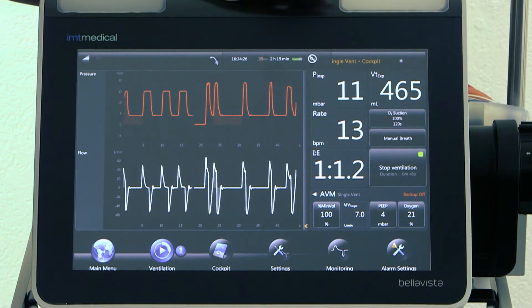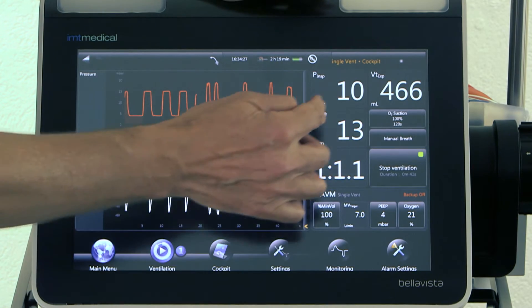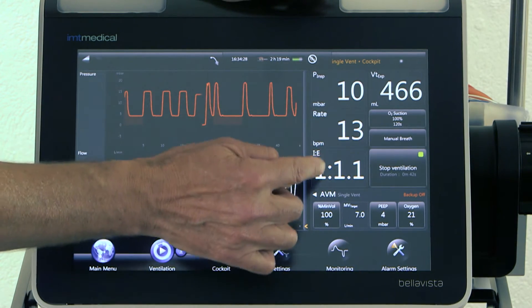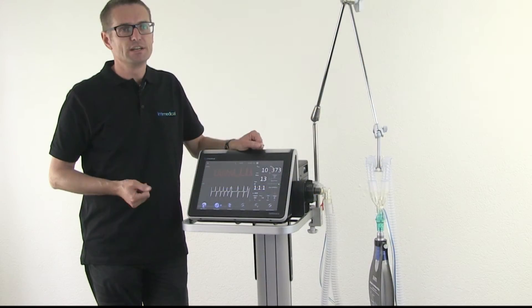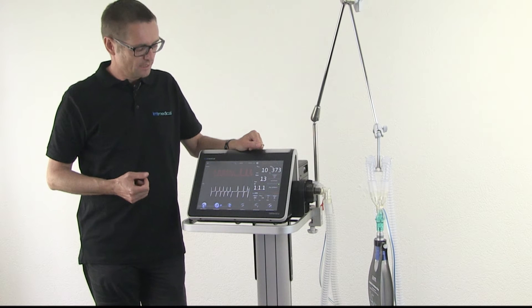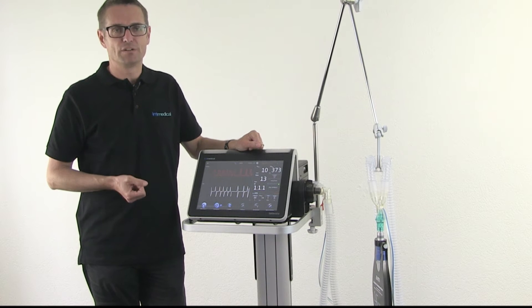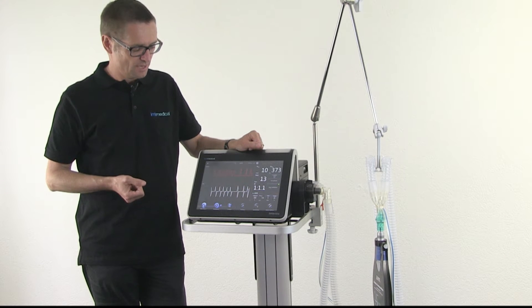Completely automatic. It adjusts the rate, it adjusts the I:E ratio — everything based on the lung mechanics of the patient.